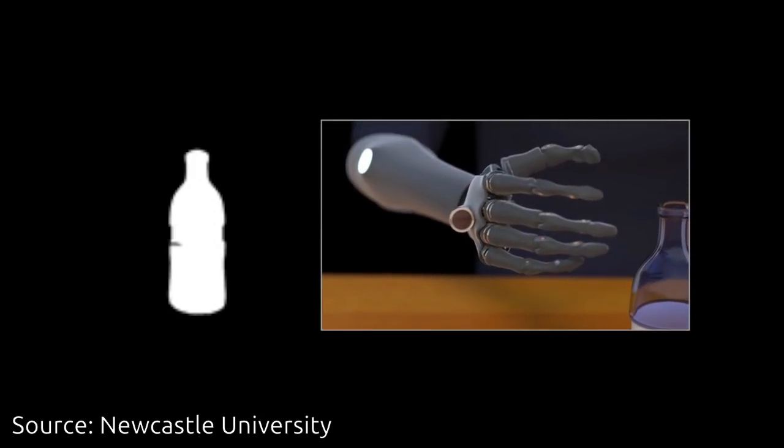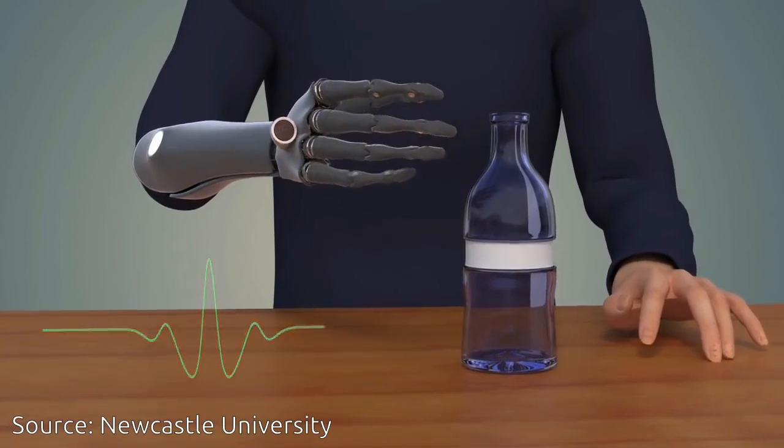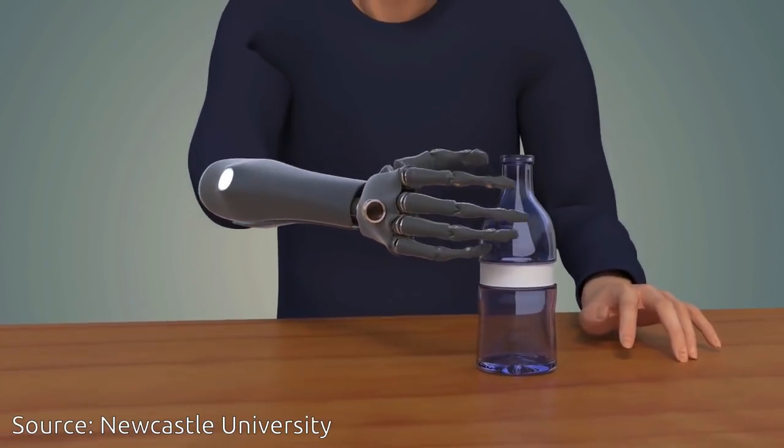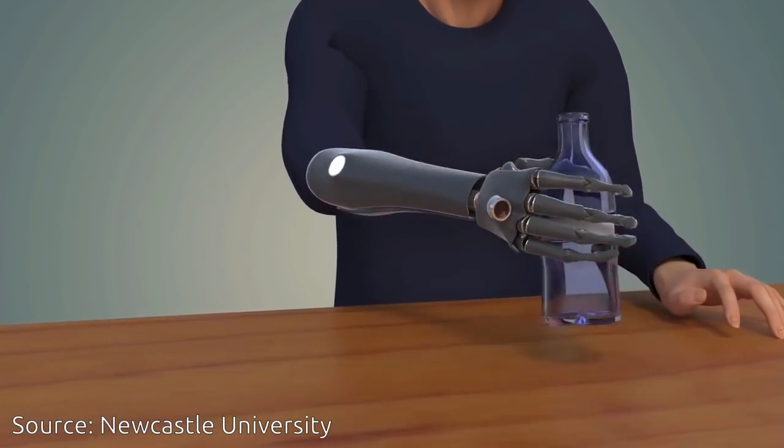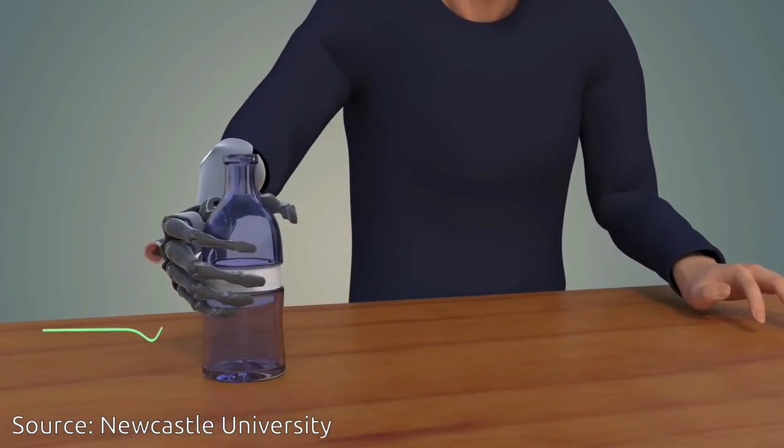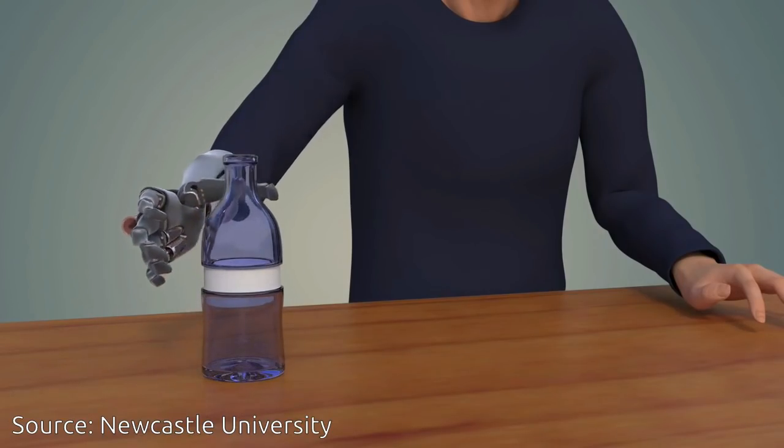Led by biomedical engineers at Newcastle University, the bionic hand is fitted with a camera which instantaneously takes a picture of the object in front of it, assesses its shape and size, and triggers a series of movements in the hand.